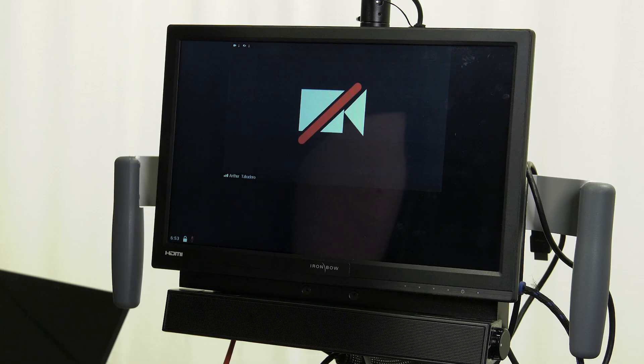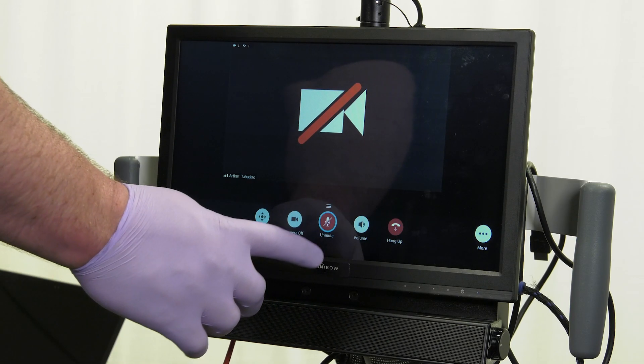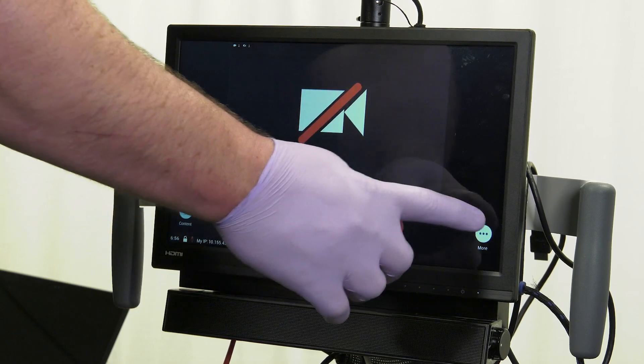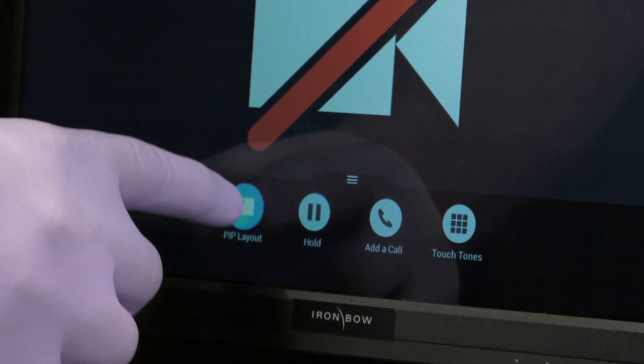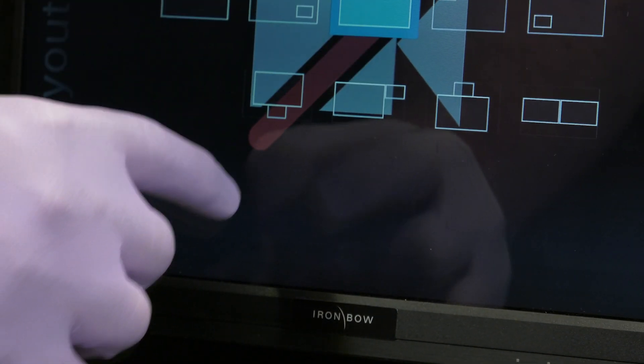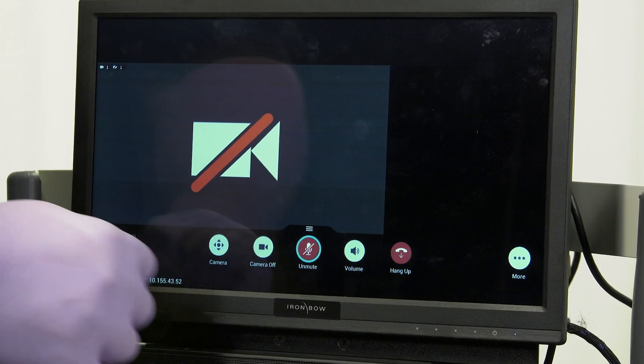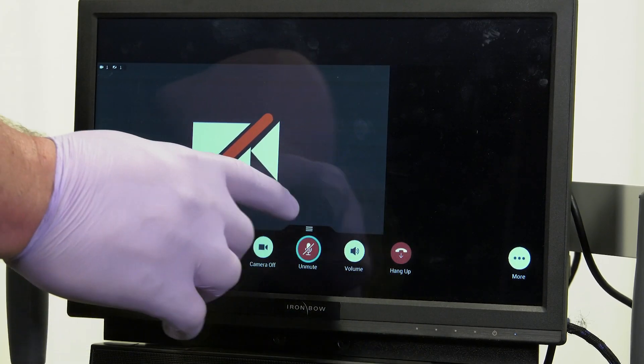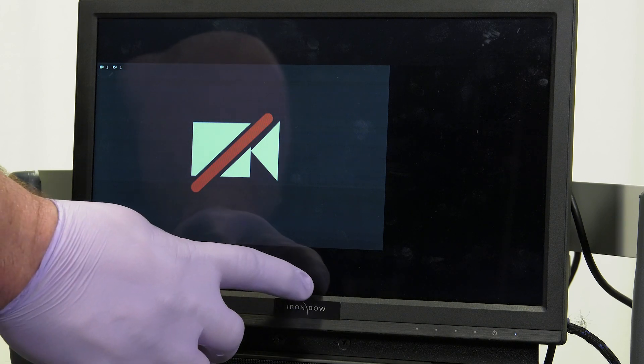You can adjust the screen to various layouts by tapping the PIP Layout Options via the on-screen video controls.